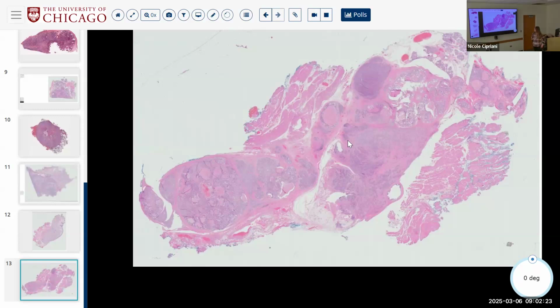Yes, so clear cell RCC can metastasize to thyroid, we know is common, to jaw, to salivary gland, to oral mucosa, yes. So that would be easy to do with like a PAX8, CA9, all those renal things. Presumably, metastatic RCC would also be negative for your high molecular weight keratins, your P40s, P63s.